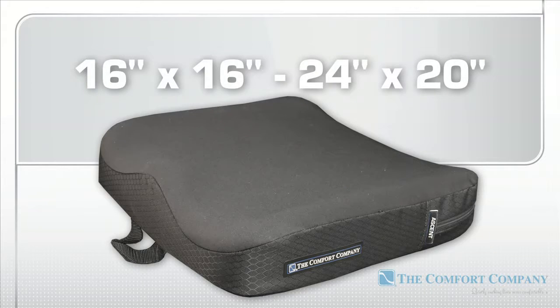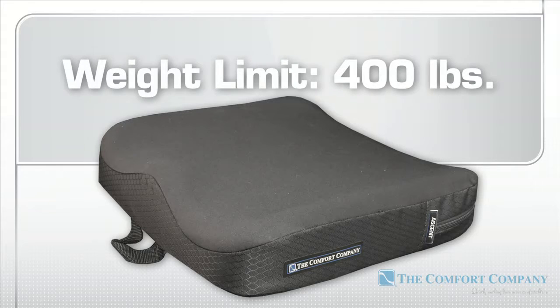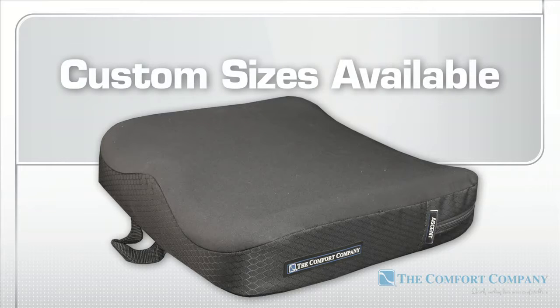Cushions range in sizes from 16 by 16 inches all the way up to 24 by 20 inches, and can support body weights of up to 400 pounds. Non-standard sizes are available.